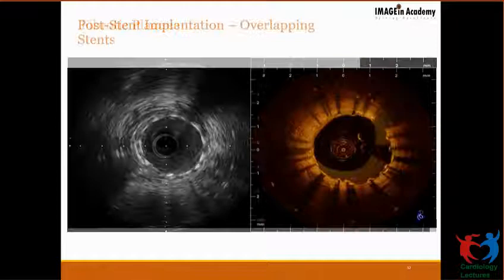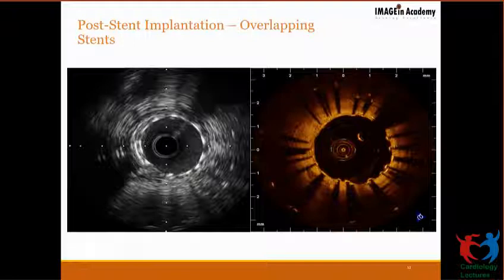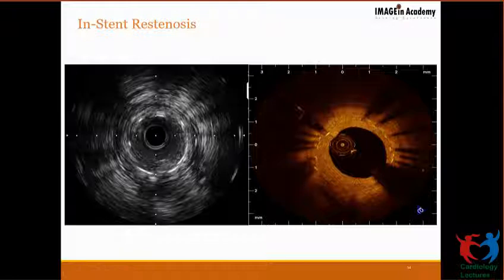Now, once you've implanted the stent and you have overlapping stents, you can see here with the OCT the two stent struts overlapping with each other. It becomes slightly difficult with the IVUS. Now, if you have an ISR, again, the plaque morphology superficially is much better with OCT. But if I have an underexpanded stent, which is deep down in the tissue, I will pick it up much better with the IVUS because it has greater depth compared to the OCT. So underexpansion or sizing of a previously implanted stent is much better with IVUS.